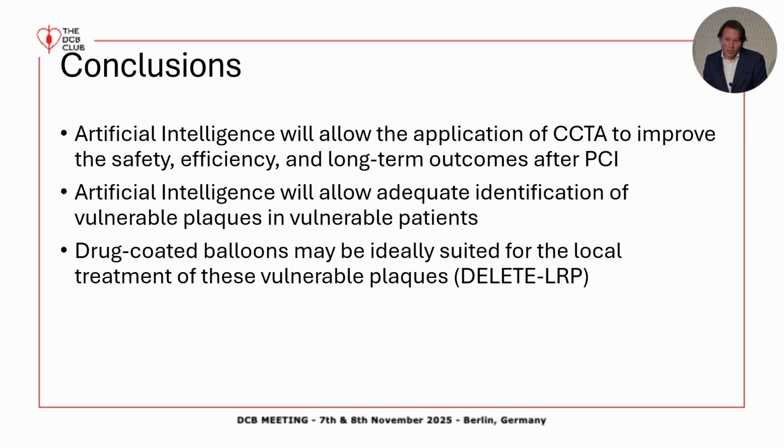Artificial intelligence will also allow the adequate identification of vulnerable plaques in vulnerable patients. There are already many algorithms out there, which mean that you don't have to be Akiko Mihara, but you can just be yourself, and you can also still see all these details in the entire pullback of the intracoronary imaging that you're doing. And ultimately, we're investigating whether these drug-coated balloons may be ideally suited for the local treatment of vulnerable plaques.